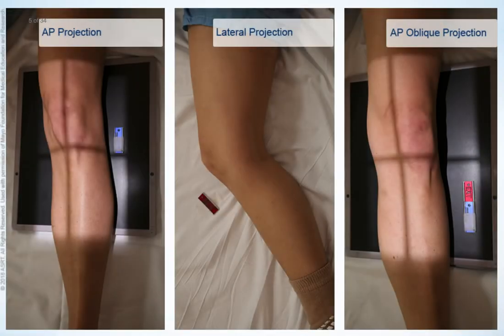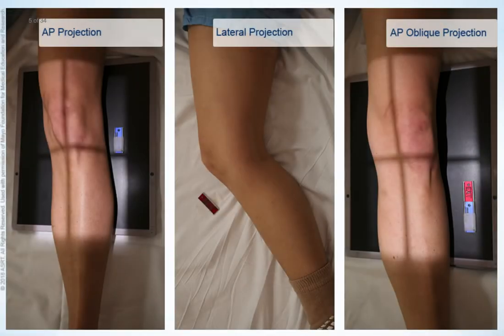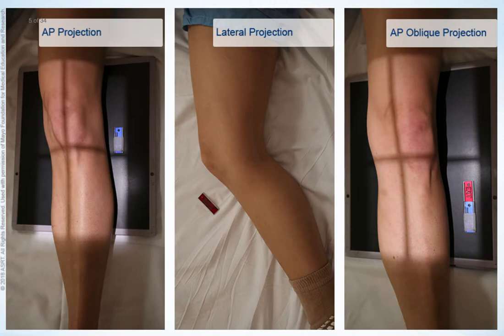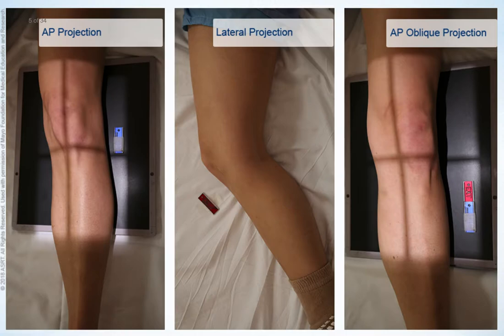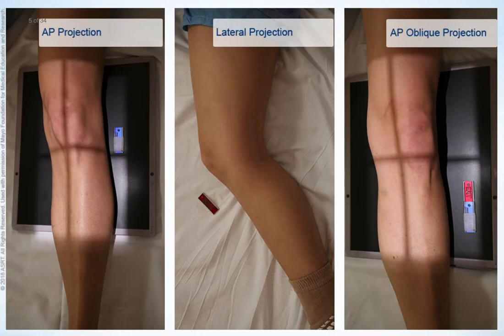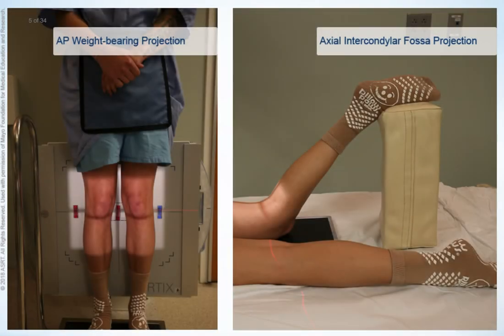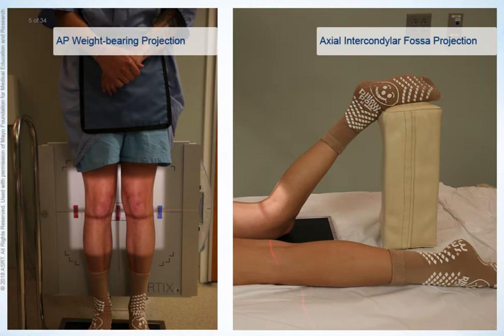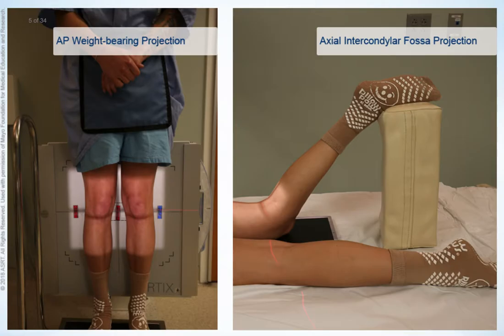Examinations of the knee generally include AP, lateral, and AP oblique projections. Additional projections may be performed to demonstrate specific structures and the functional status of the knee. Other commonly performed projections include an AP weight-bearing view and axial projections of the intercondylar fossa.